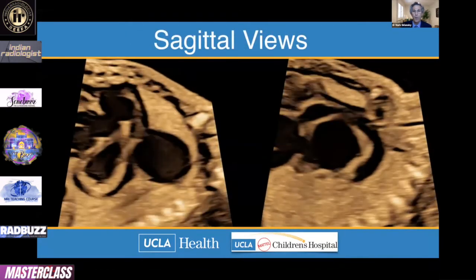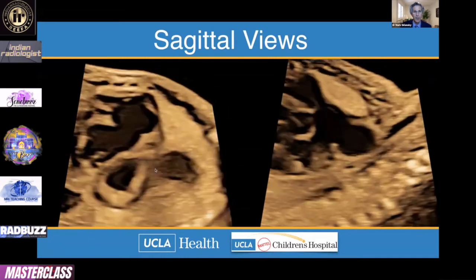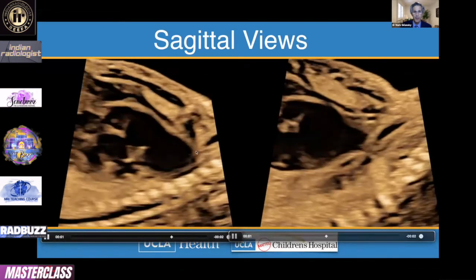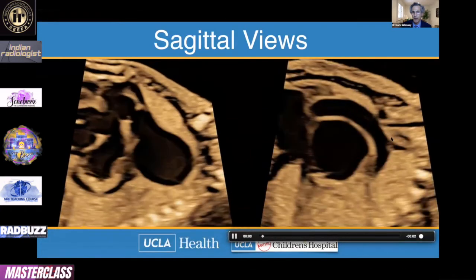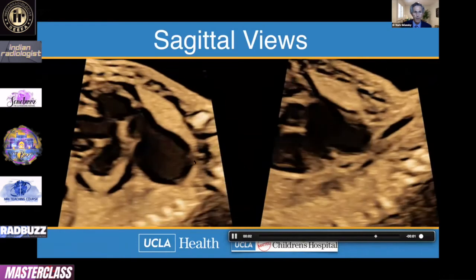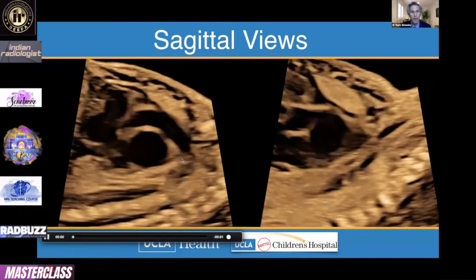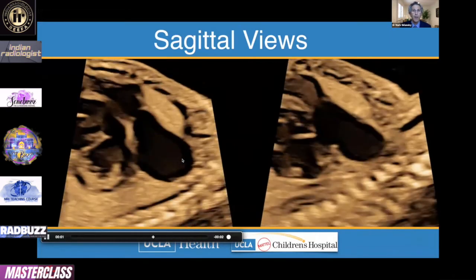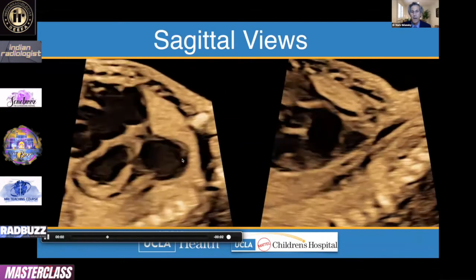And here you can see why these babies are at risk for airway disease. Look at how big these pulmonary arteries are, and you can see the trachea starting to come through. Look here, you can see the trachea being compressed right here. And on the left, you can also see the trachea is being compressed by the branch pulmonary arteries, and that could cause major airway issues after birth, could cause difficulties breathing, could require intubation.